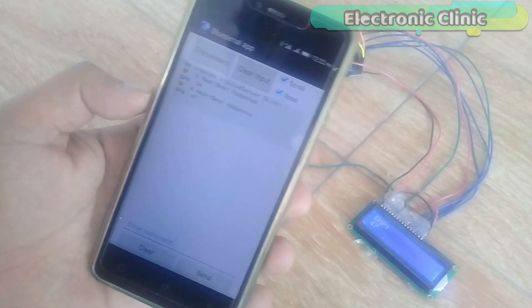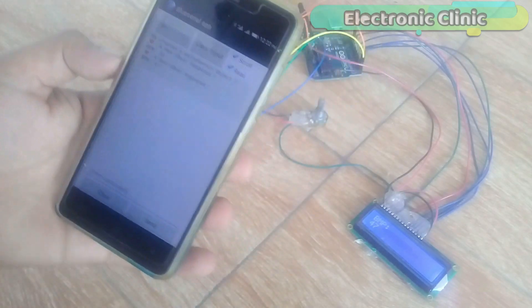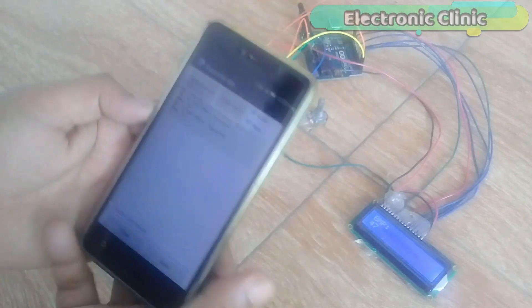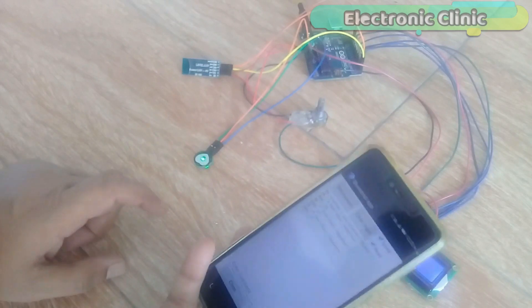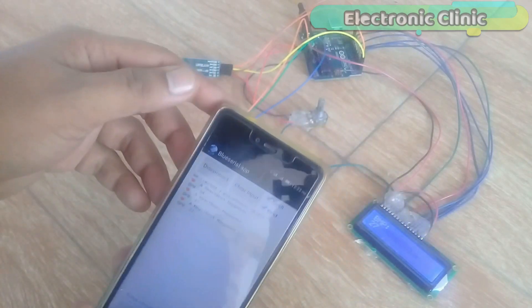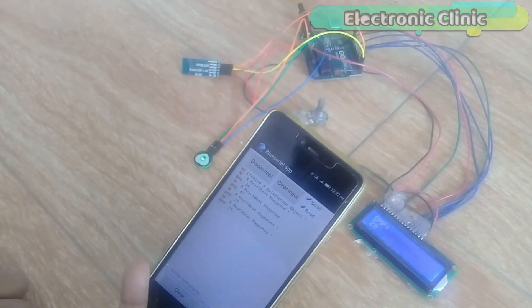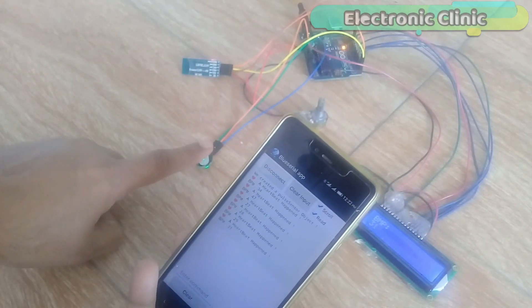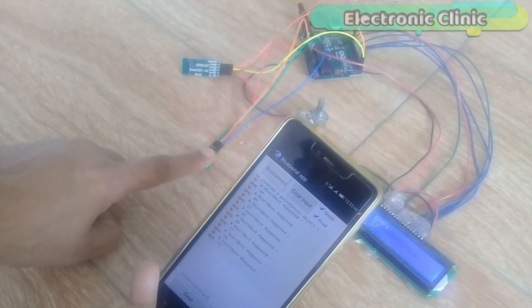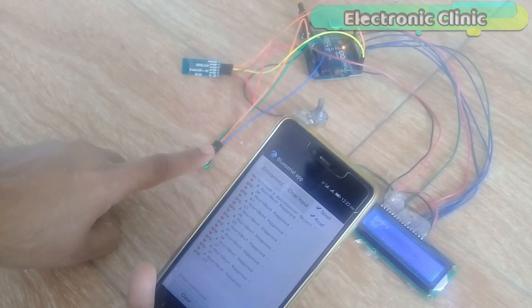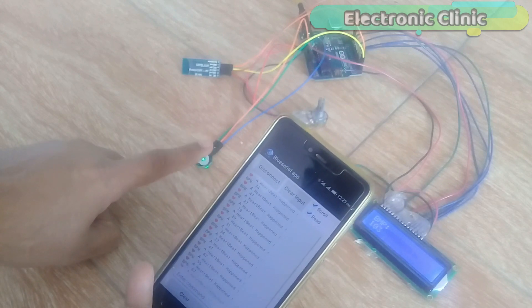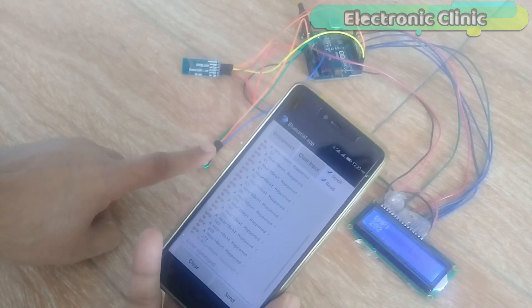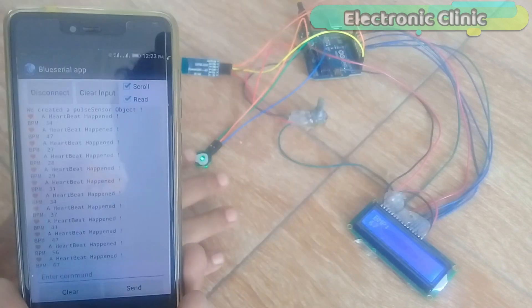In today's episode, you will learn how to wirelessly monitor the heartbeat rate or heartbeats per minute using the pulse sensor Arduino, a 16x2 LCD and HC05 or HC06 Bluetooth module.